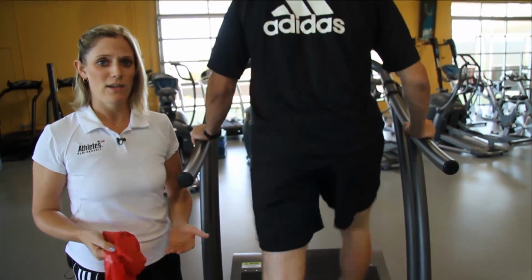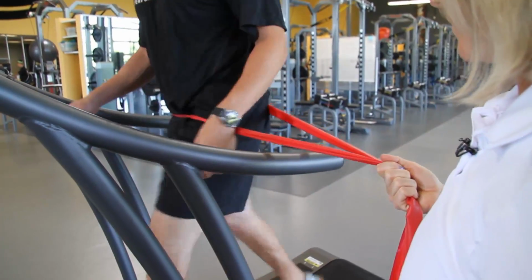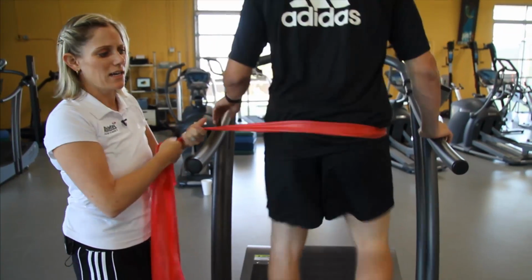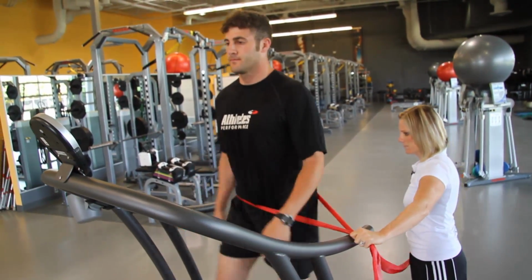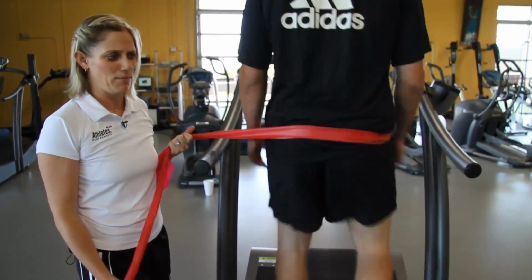So what we can do is use this band. I'm going to put the band around his waist, over his hips low. While you can do this on the motorized treadmill or on firm walking, the Curve is a unique tool for this because it allows us to amplify the dysfunction with the patients, as well as challenge the patient's sense of proprioception and balance.